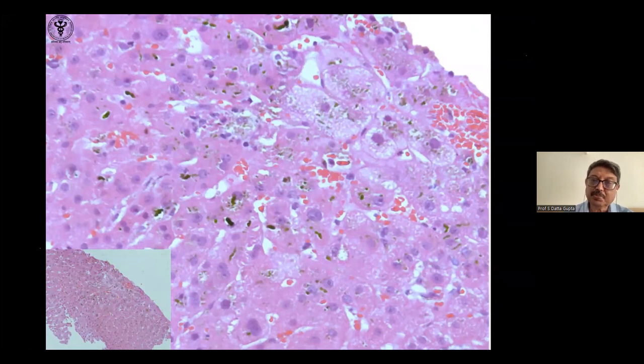Now, there are certain specific terms that we use when we see bile. It is called bilirubinostasis, because bile is made of bile salts and bile pigment. What you see in this green color are the bile pigments. It is bilirubinostasis. The bile salts are toxic. Bile pigment is not toxic.